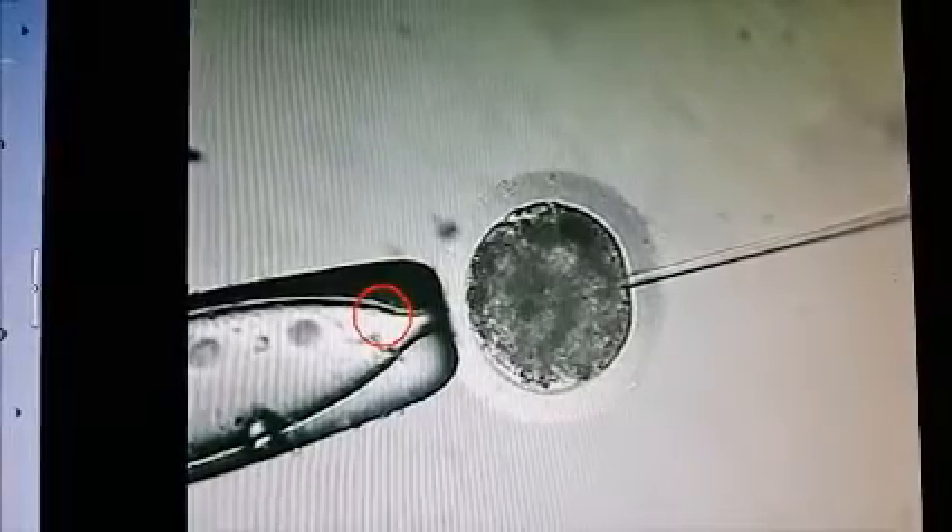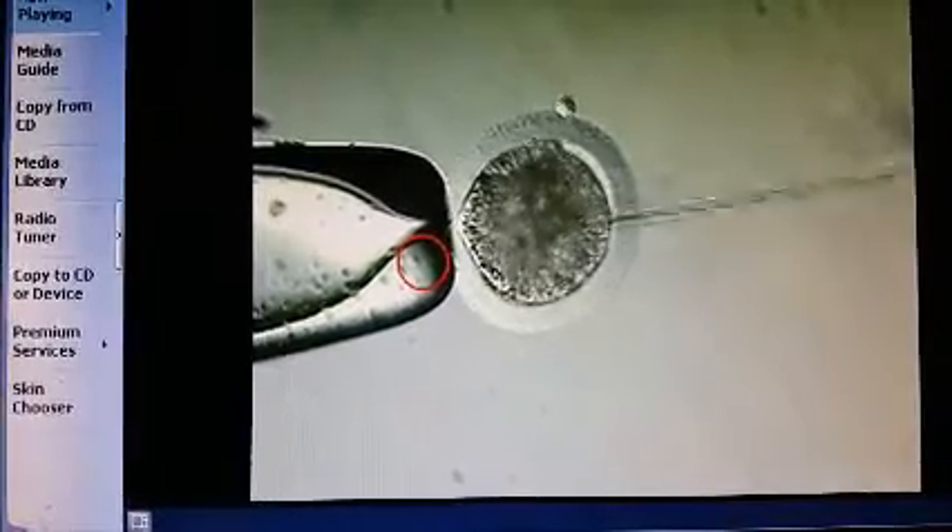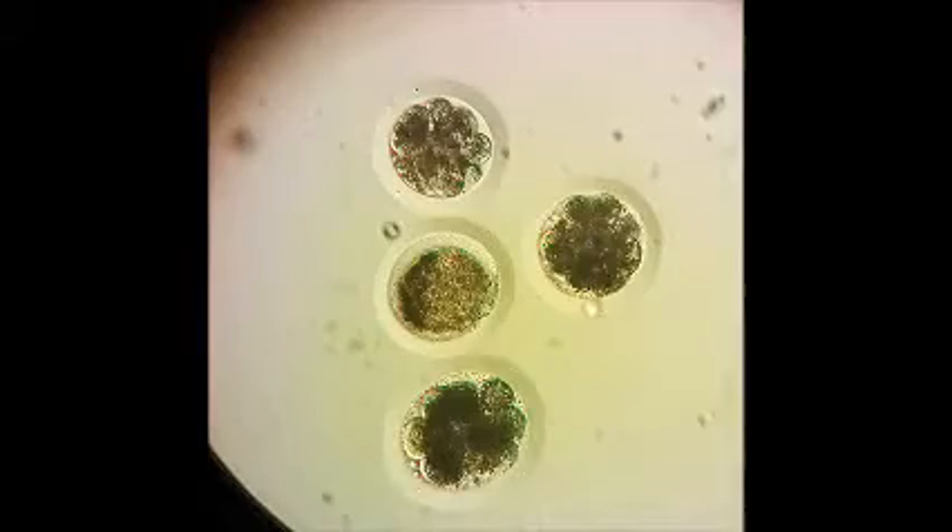We search in a gridded search dish, the same one we use to search for embryos, and it is on a heated stage. Everything must be temperature controlled with oocytes, more critical than with embryo searches, because these are much more temperature sensitive than embryos are.